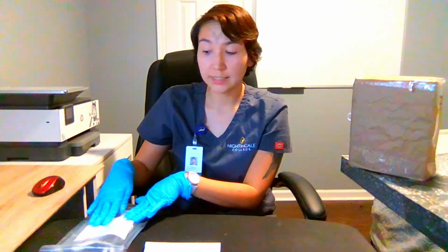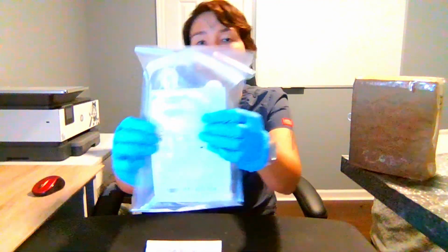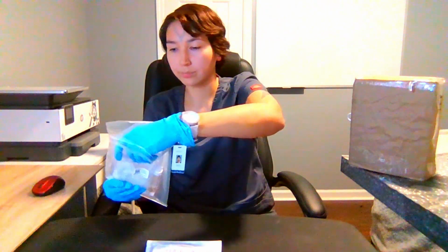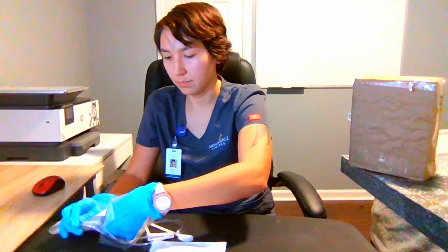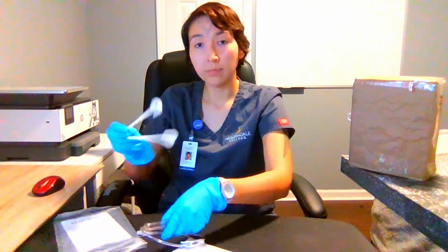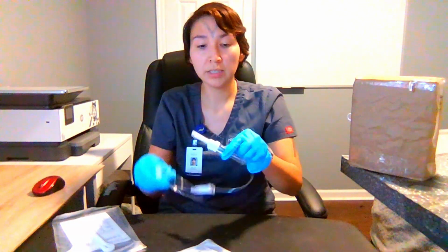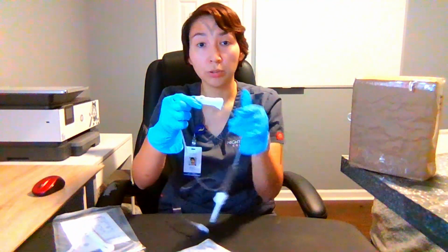This is the secondary set tubing. It is also labeled with a drop factor of 15 per ml. It comes with a hook, and its components are a spike end, drip chamber, roller clamp, and adapter end.